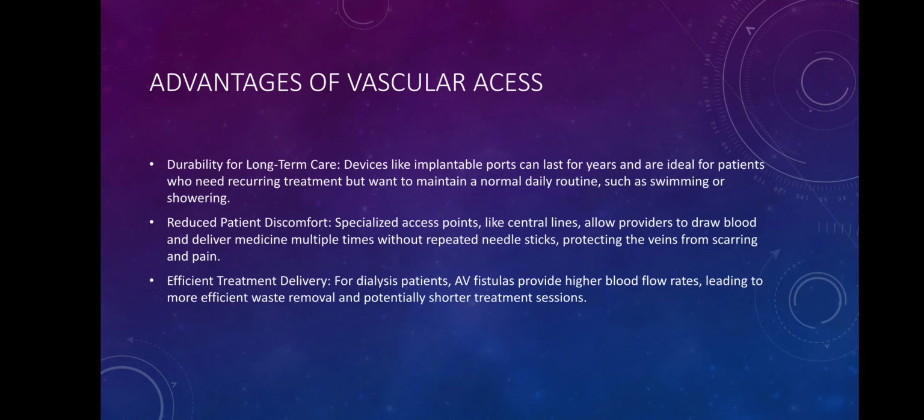Advantages of vascular access. First one is durability for long-term care, then reduced patient discomfort, and efficient treatment delivery. Durability for long-term care means devices like implanted ports can last for years and are ideal for patients who need recurring treatment but remain in their normal daily routine, such as swimming or showering.